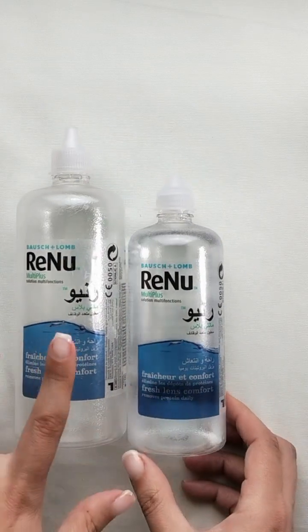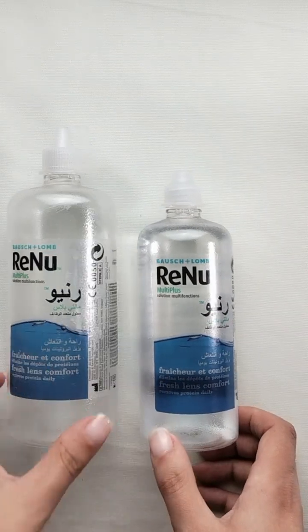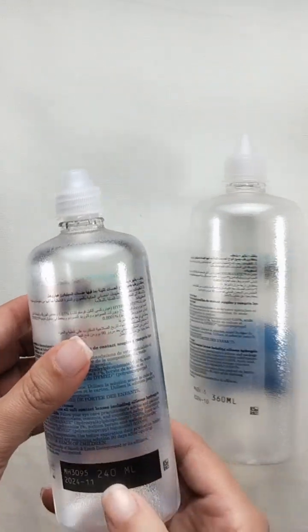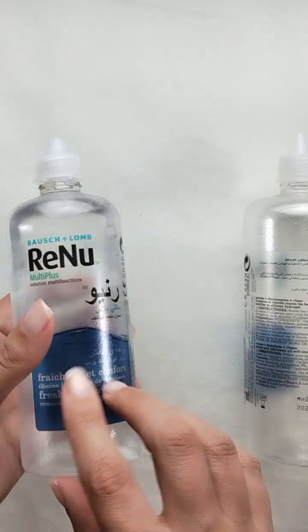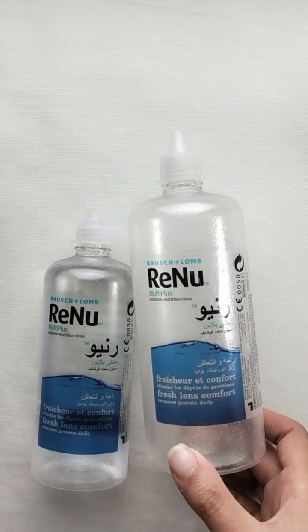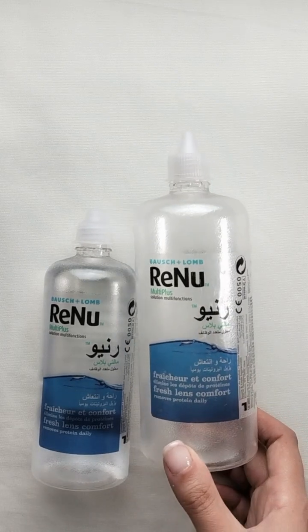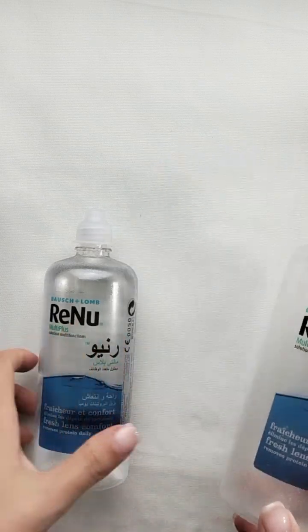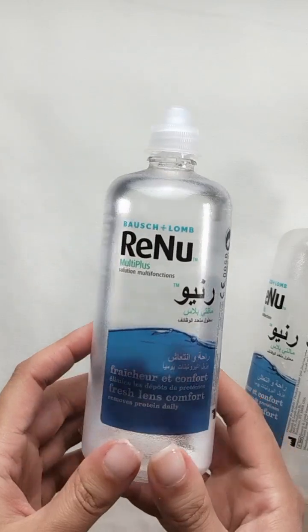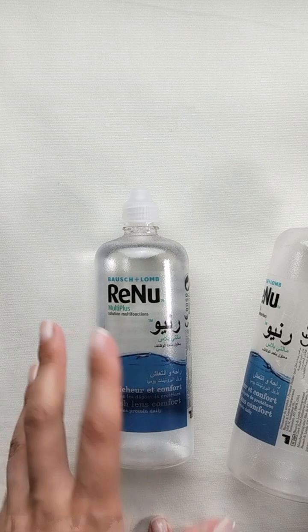I have two sizes here. I usually use the bigger size, but if I can't find it I go for a smaller one. The bigger one is 360ml, this medium size is 240ml, and there's also a 120ml. I always go for the bigger one because I have a lot of contact lenses and I always change the solution so they stay fresh. The price is a little bit high compared to other solutions.